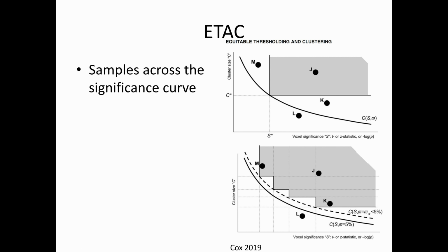And as you require a more stringent voxel level p-value, your requirements for your cluster size are going to go down.